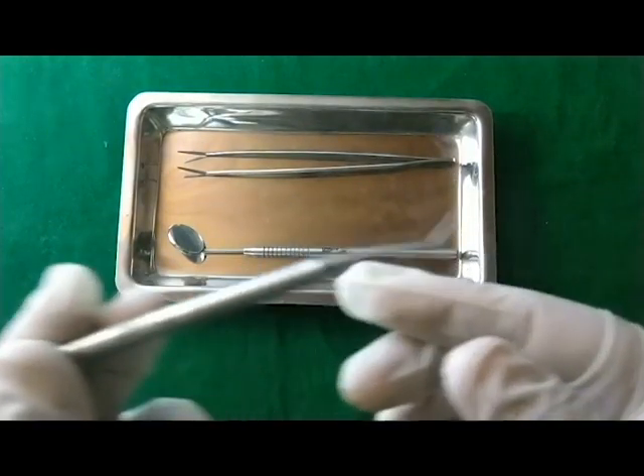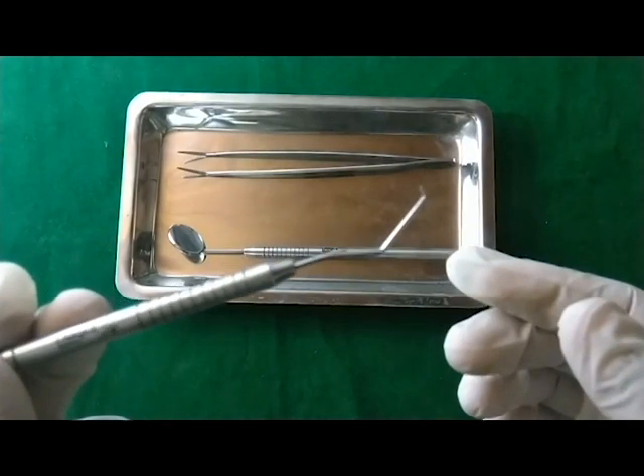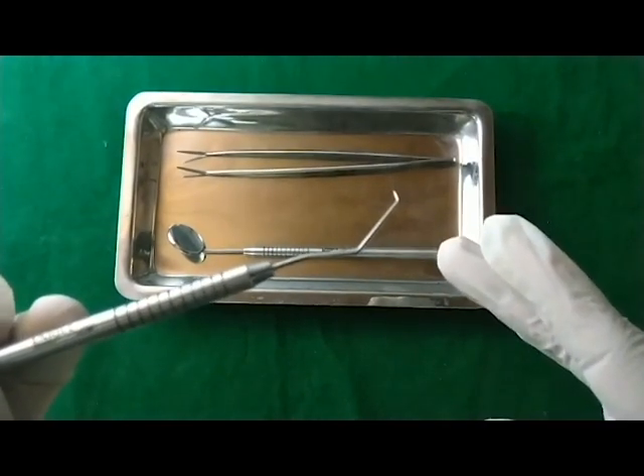Secondly, these explorers can be used to detect caries on the mesial and the distal sides of the tooth.